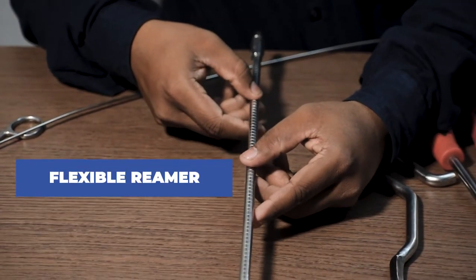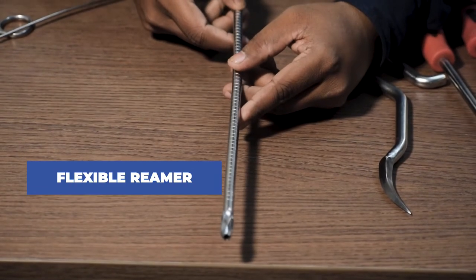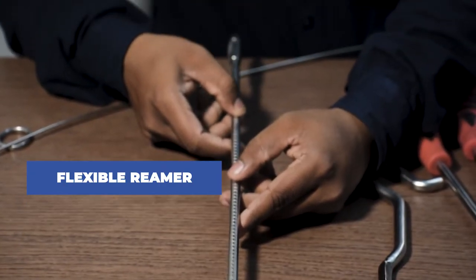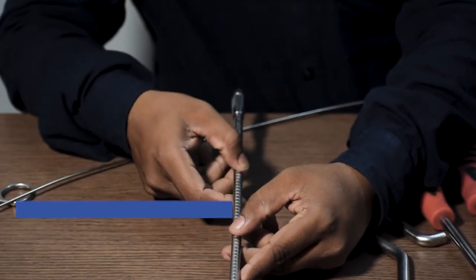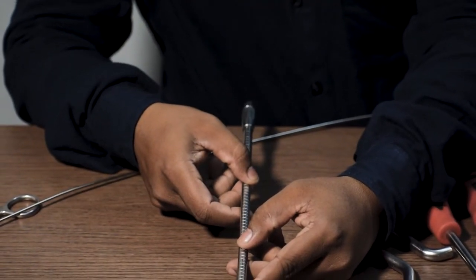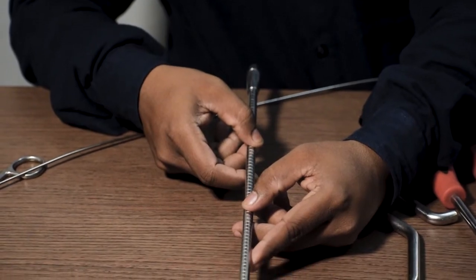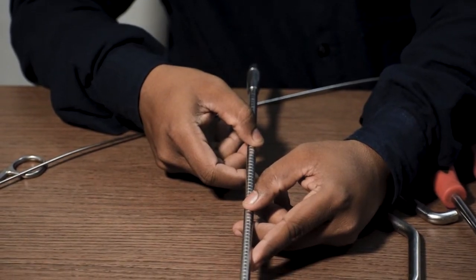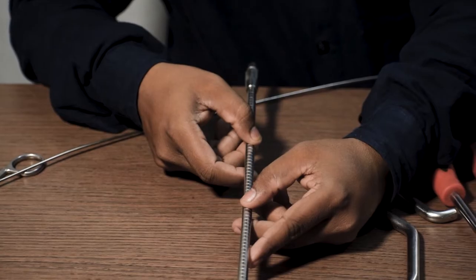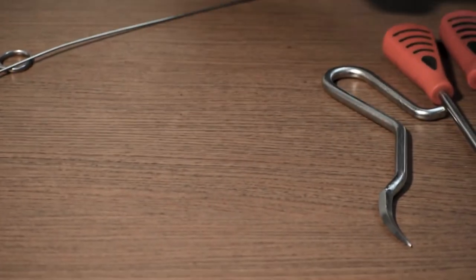This is a flexible reamer. It has the same function like a hand reamer. This comes in the difference of 0.5 mm. For example, if the nail used is of 8 mm, so we have to ream 1.5 mm extra than the diameter of the nail.